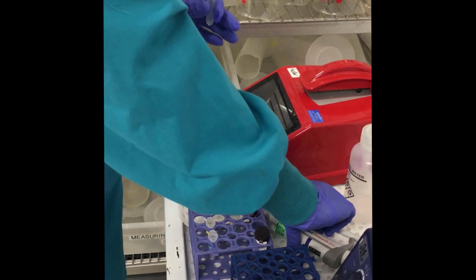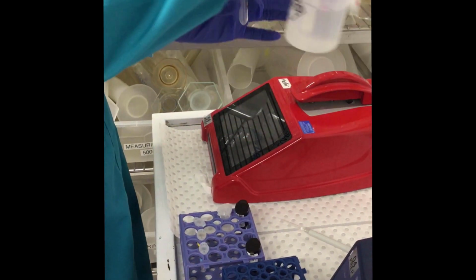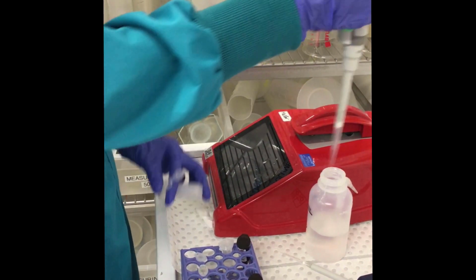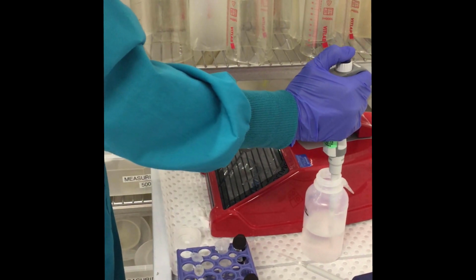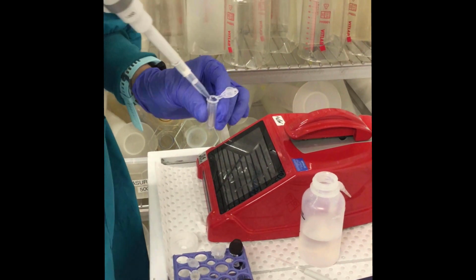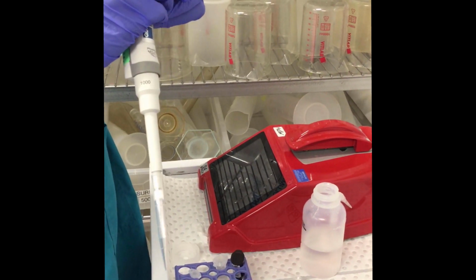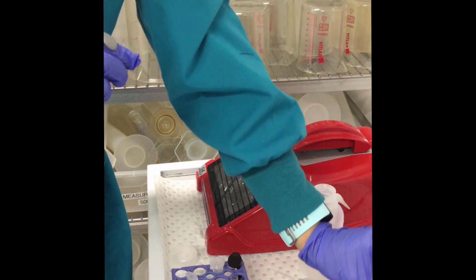We're then going to add 780 microlitres of deionized water. We're going to cap that and give it a quick vortex.